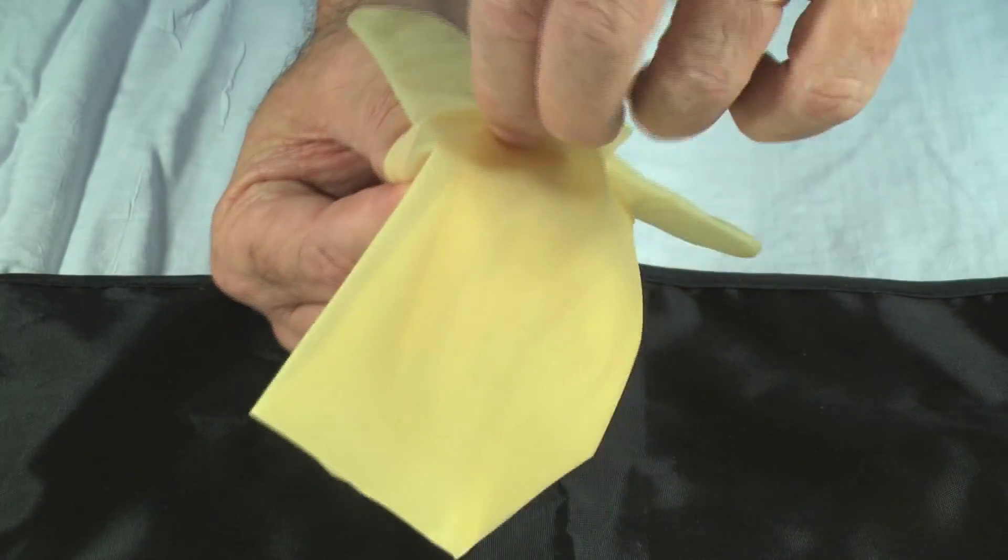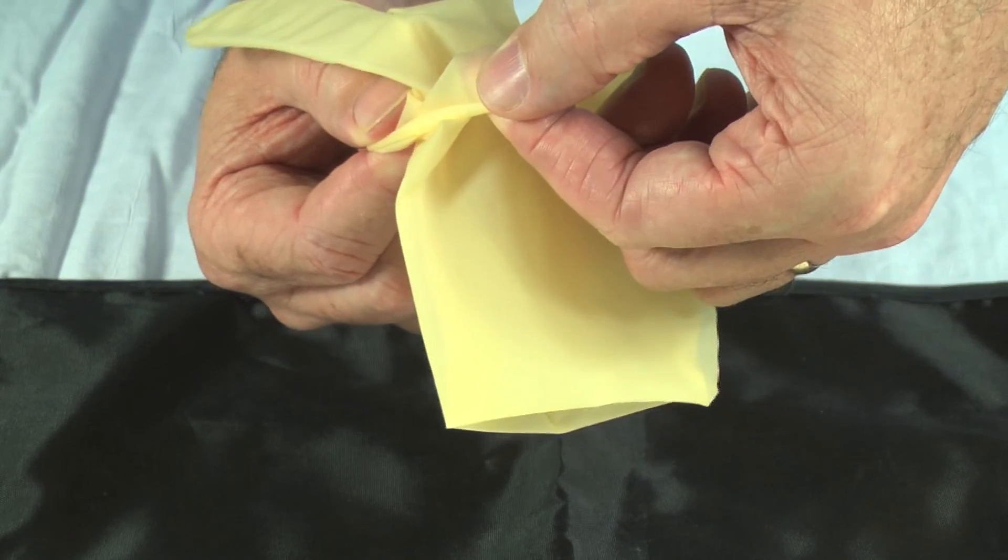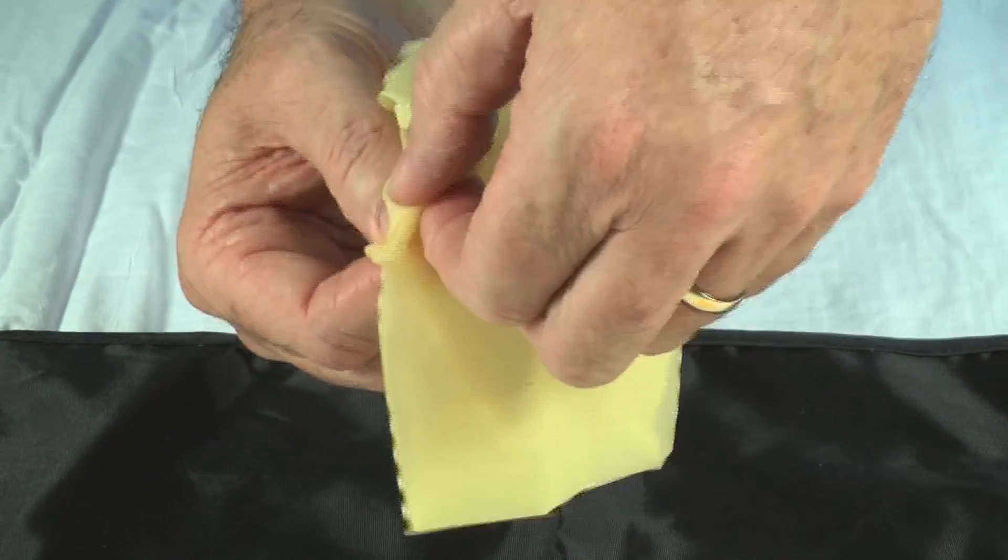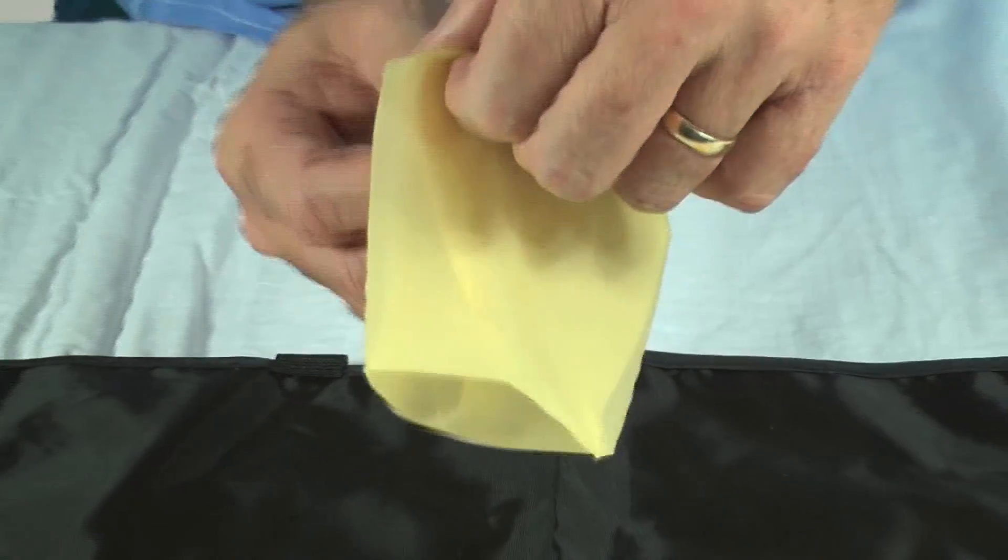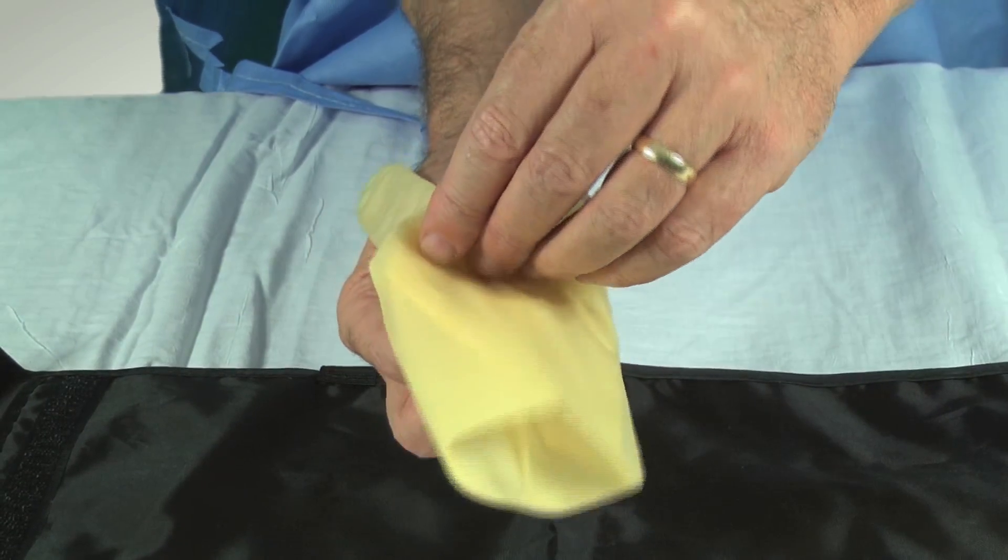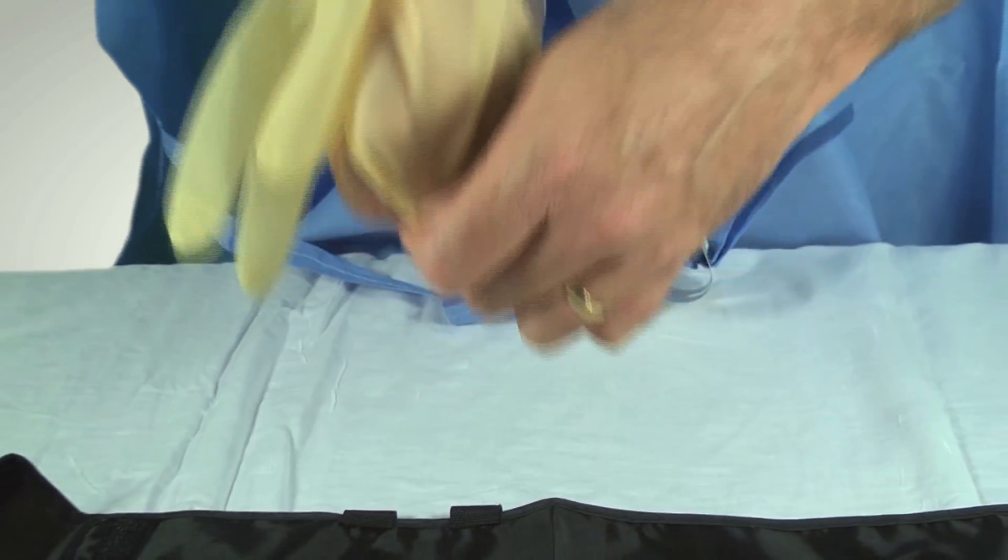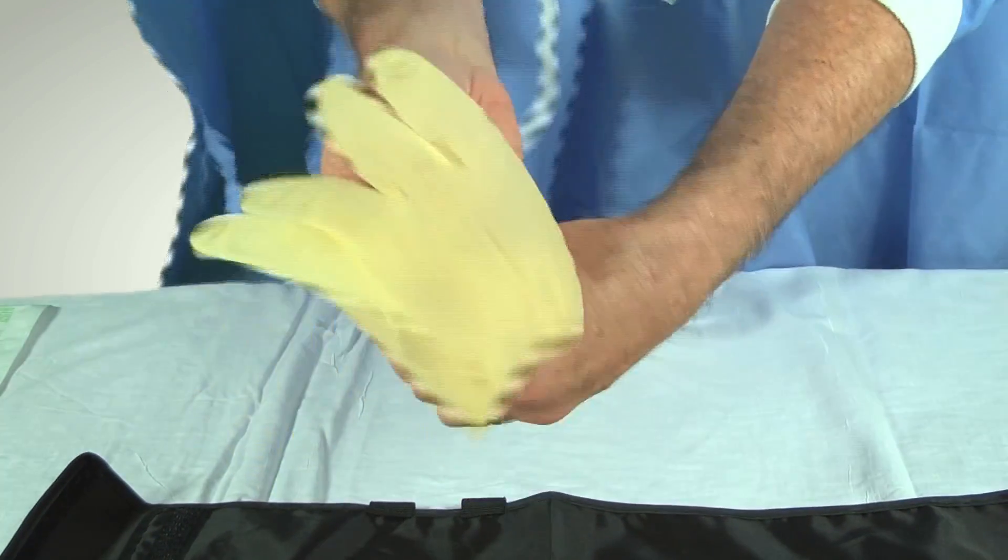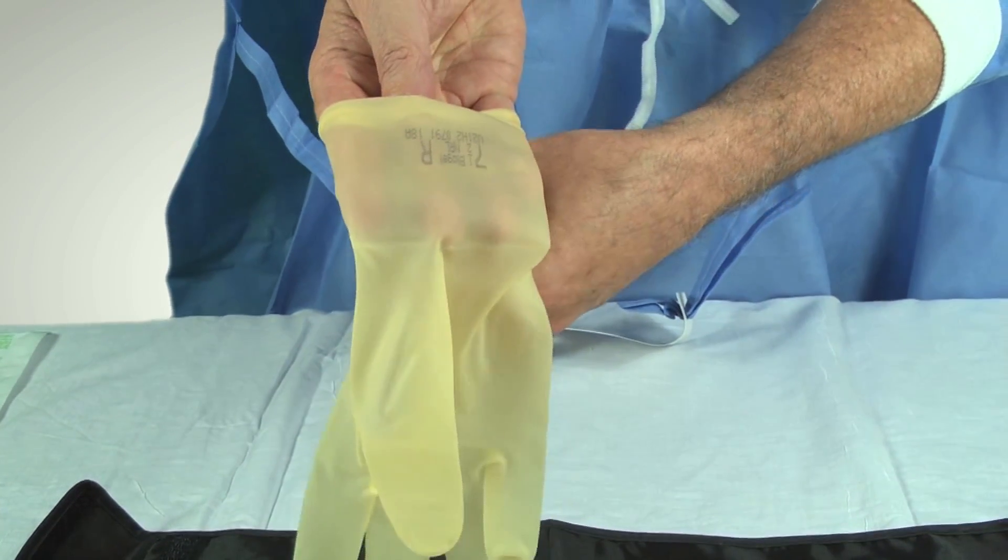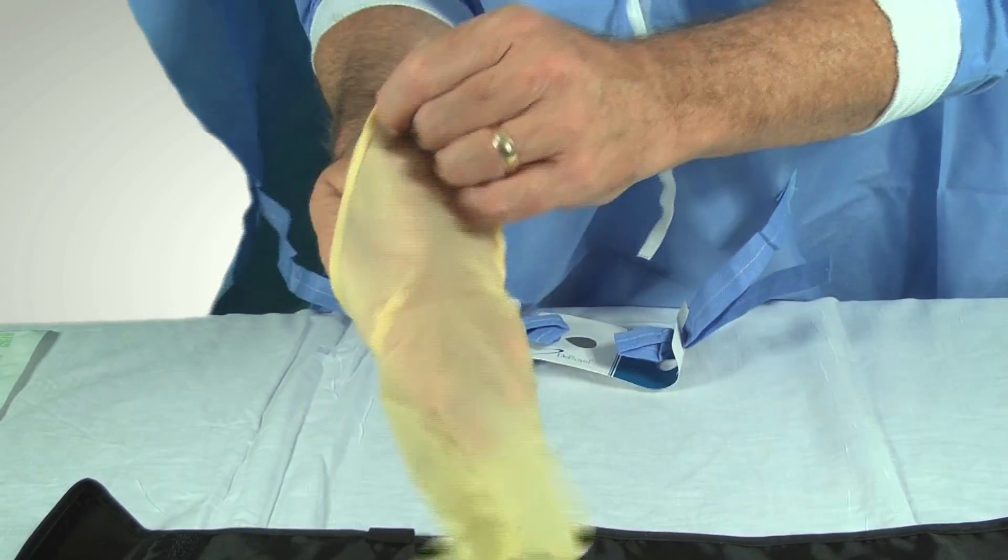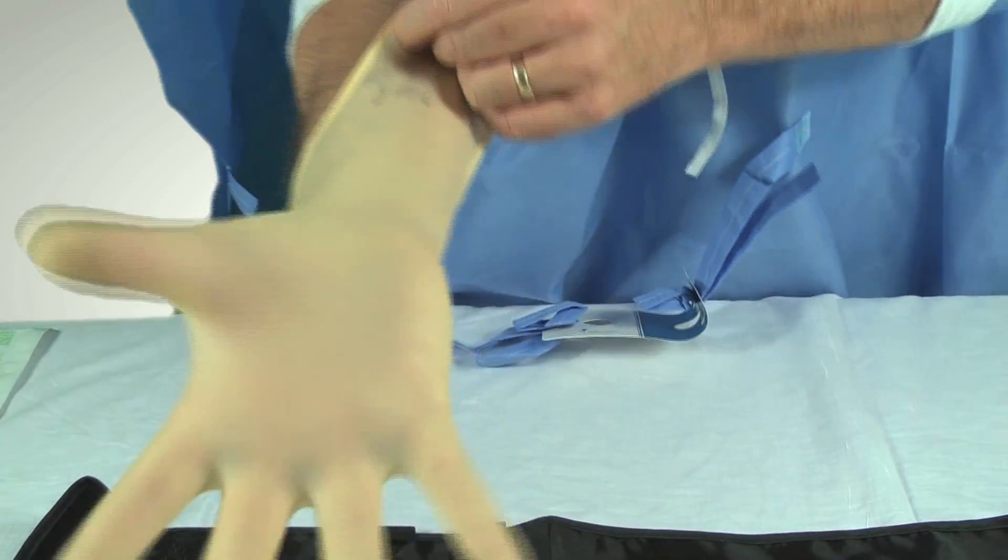This and this alone. Over here you grab this and this alone. Again, not this plus the finger, that will get everything all mixed up. You grab this and this alone, then you do the flip. You've now done the flip and completely covered everything. Now you do my little dangle it down thing, and then you're able to zoom right up in there.